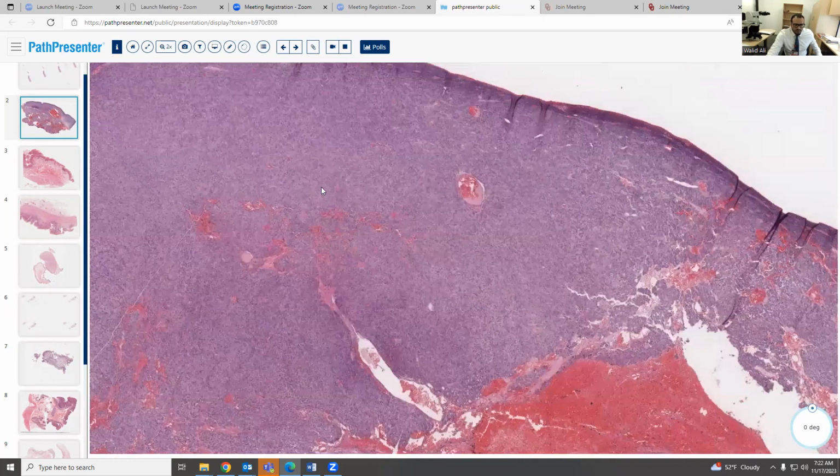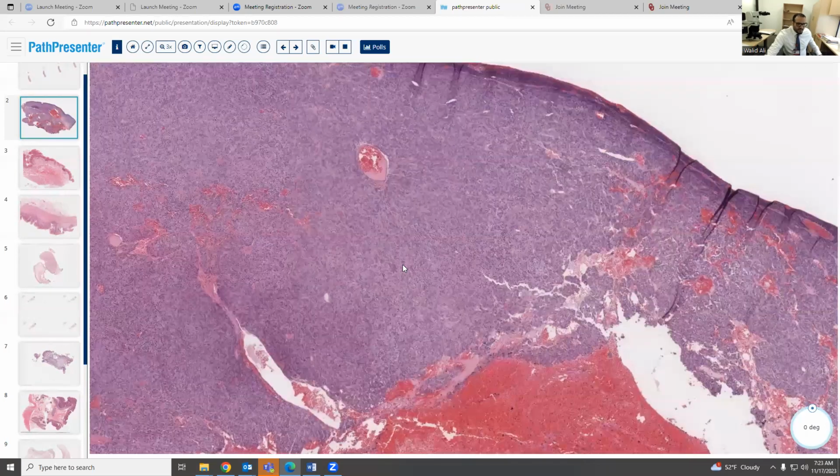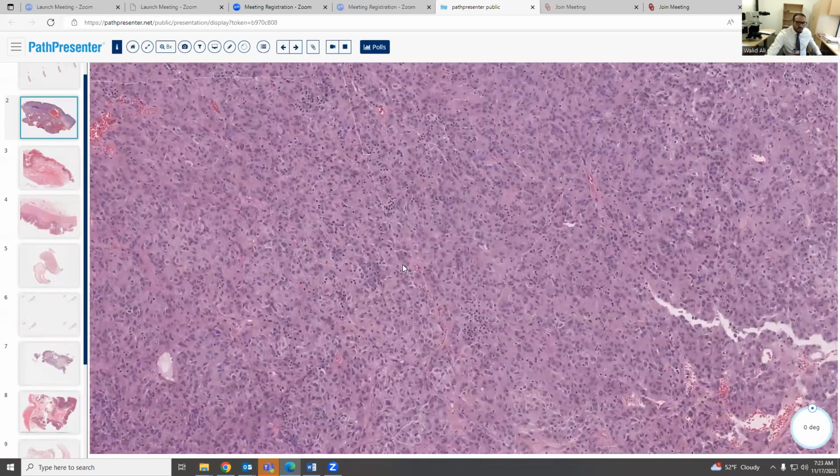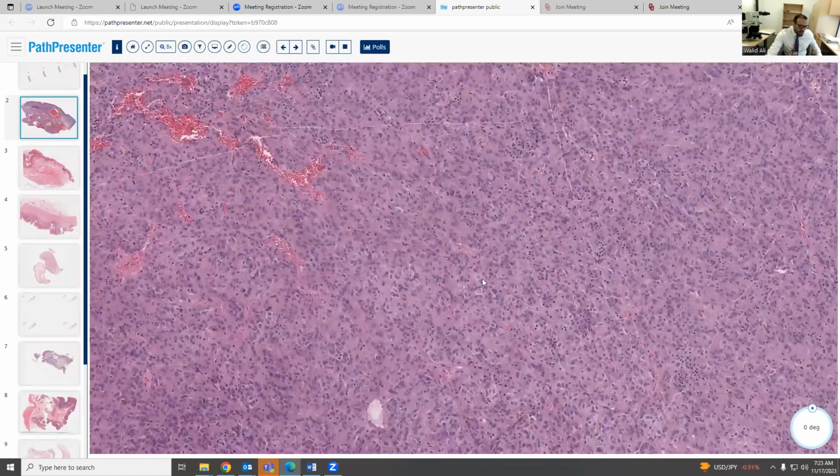I brought this case to be open-minded and think out of the box. Even if this is not stomach or small bowel and it looks epithelioid, you should also think about GIST and put it in the differential. GIST is one of the most common tumors in the GI, but the stomach is the most common site.